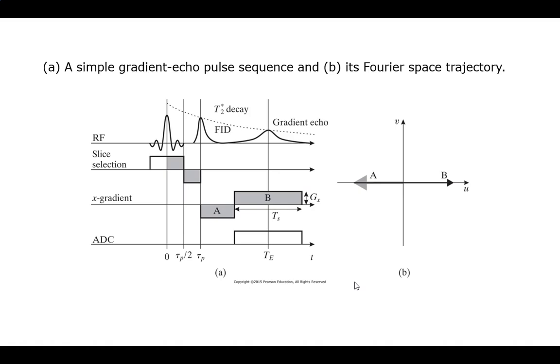Nicely, I can just kick them in opposite directions. And these are just, remember, the square ones are gradient magnets. How do they adjust my speed? So just spin them a little bit the opposite and then let them flip back. And that's just going to be little adjustments of their frequency speed. Okay, does this make sense?